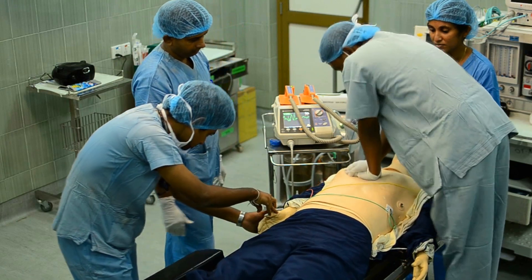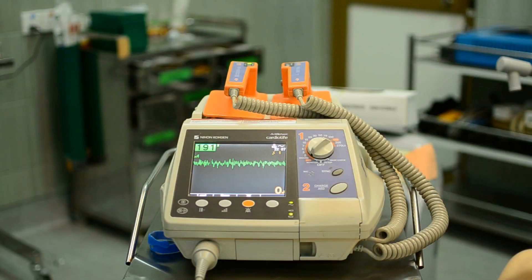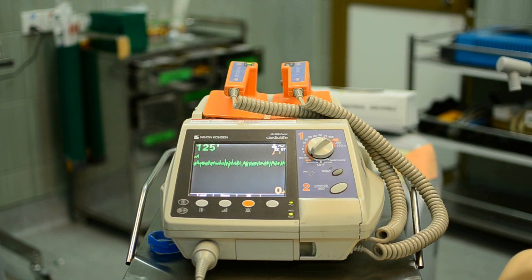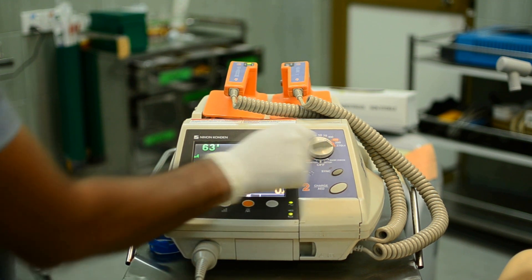Continue CPR for another 2 minutes before assessing the rhythm again. For re-assessment, you don't need to turn the energy selection dial back to the monitor position — it will monitor the patient at the current position. For the next shock, you need the maximum energy level. Therefore, you may turn it to the maximum energy level and wait for the 2 minutes of CPR.